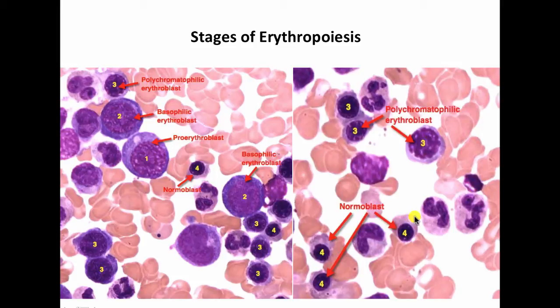The cytoplasm becomes pretty pinkish due to the large amounts of hemoglobin. The nucleus will be ejected, resulting in a reticulocyte, and once the little bit of RNA that is still left in the reticulocyte is destroyed, the cell will become a full-fledged erythrocyte.